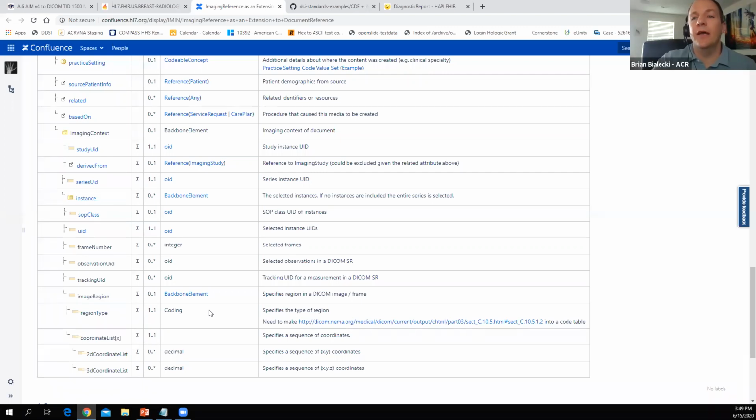Correct, but a presentation state would be its own series, and I would not be specifying the coordinates in the presentation state. The presentation state would exist in the series, and therefore I wouldn't need to use the document reference extension when I point to the observation. I could just use the document reference itself to point to the individual series or instance that the GSPS object exists in.